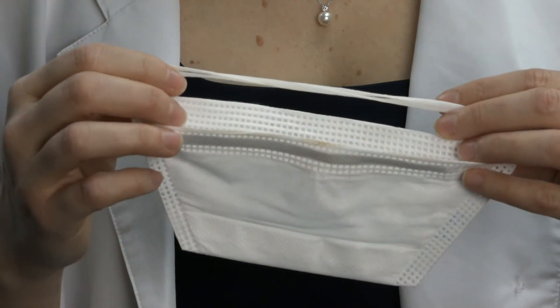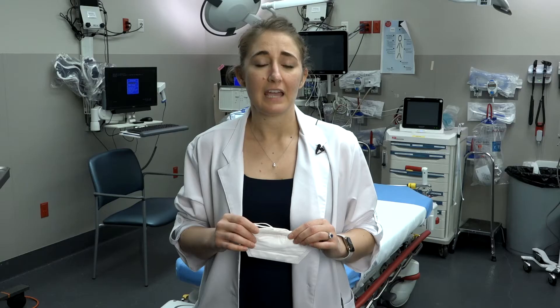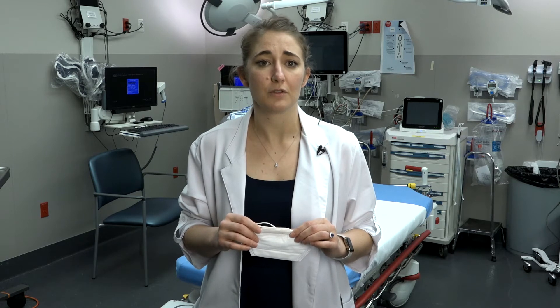The first step is to know what fit test you have for an N95 respirator. You will find this information out from your employee health department. If you are on a unit and do not see the N95 respirator you are fit tested for, let someone know so that you can retrieve it.